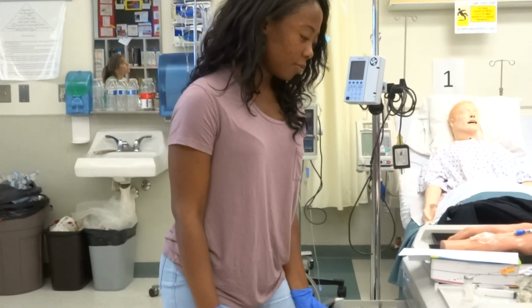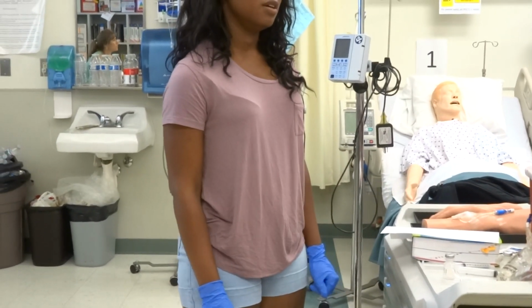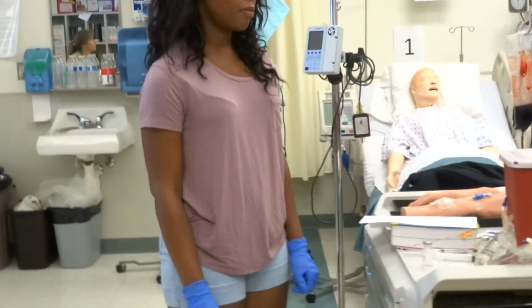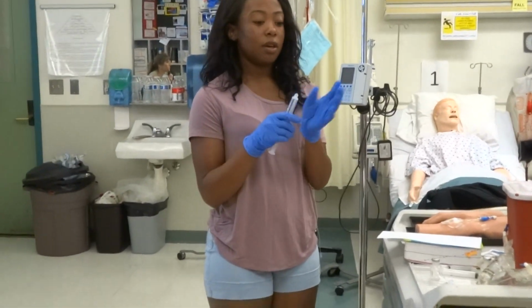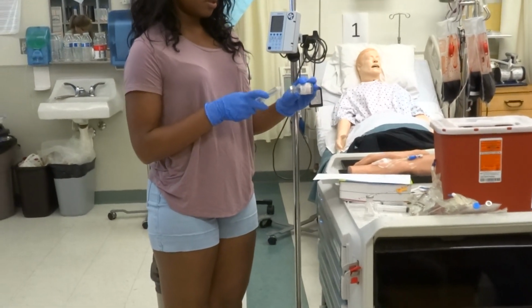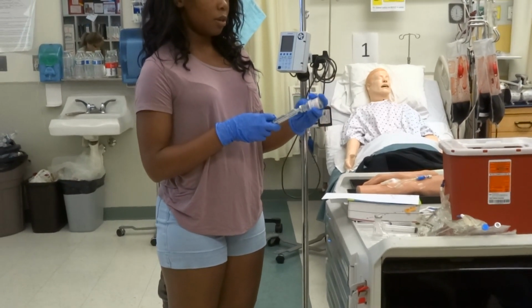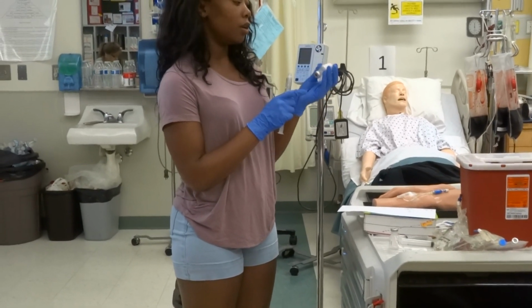Yeah, literally, you're gonna do so many Protonixes because everyone I feel like has that, and a lot of them get IV push. Okay, so you're gonna attach the 18 gauge. You're going to push all the contents, the full 10 mLs, inside. I'm pretending like this just has powder, right? This doesn't have actual liquid in it.